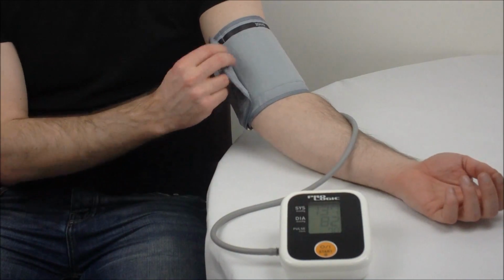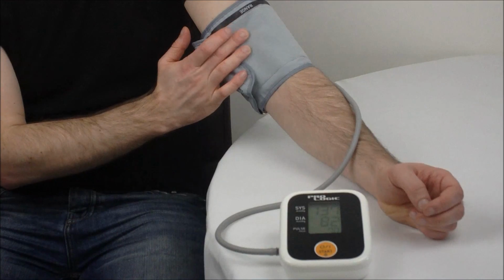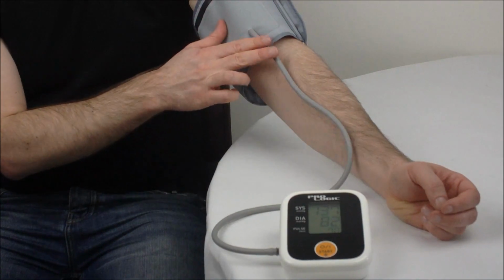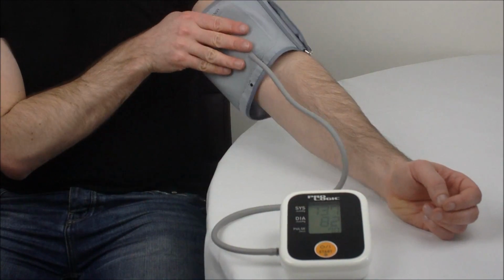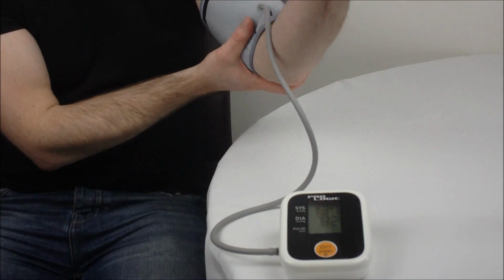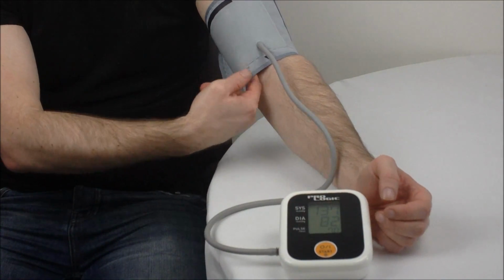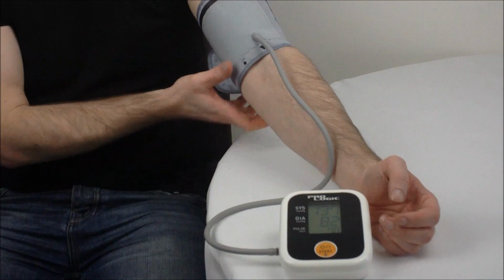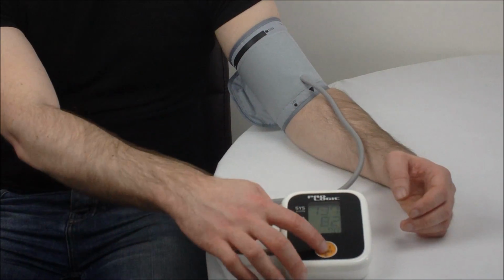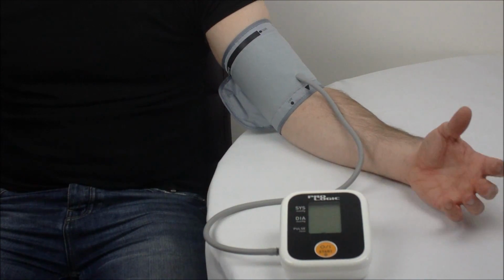There is a guide actually which says the arrow on your cuff should be within the range, so you can see on your cuff that your arm is within range. Remember that where the tube goes into the cuff, this should be roughly above your vein that you give blood at, and also you should be able to still bend your arm up. Tighten the cuff, not too tight, but tight enough to just about get a finger underneath the cuff, and again relax your arm. To take another measurement then, we're literally going to press the orange button in the middle and we will see it start to take the measurement.